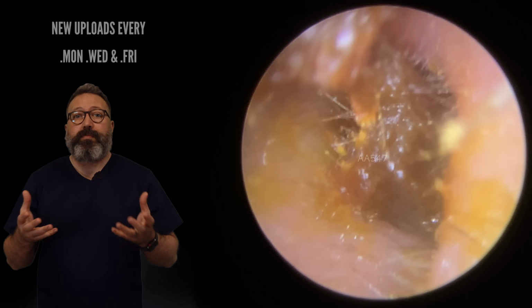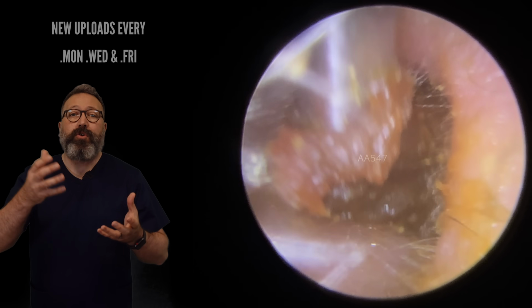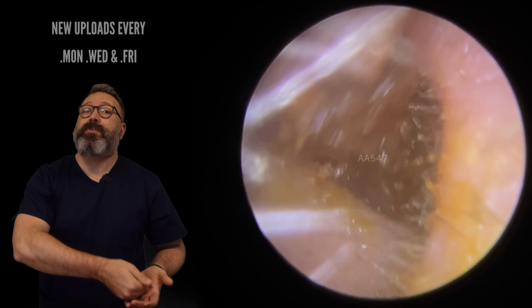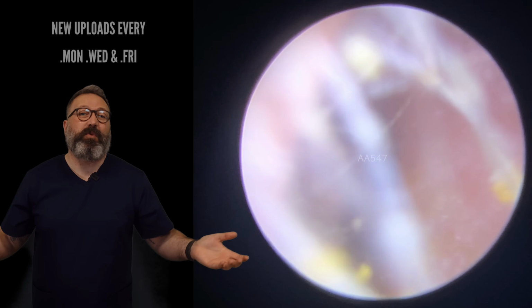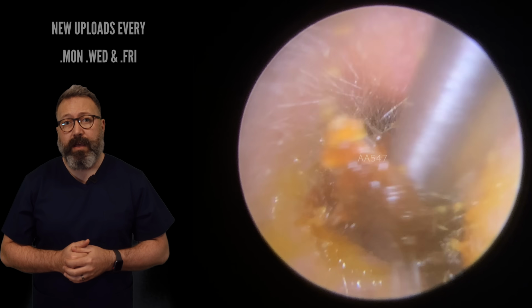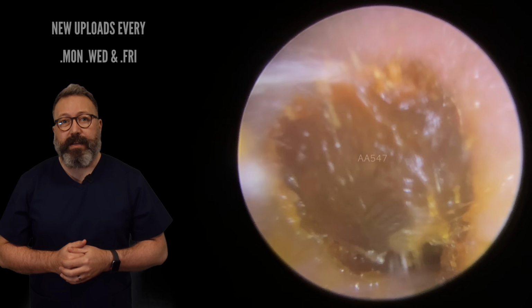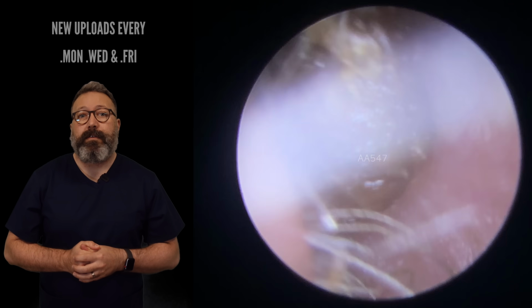So we've got two options. We can either carry on with the suction tube, which I think is what we do in this case, or you could also, when it gets to this point, drop in with the Jobson horn and draw that forward. It doesn't really matter either way, to be honest. We've used both tools, so it wouldn't really matter which one we used. But out, oh, there we go, a little bit of a wiggle, that's coming. Boosh, out he comes. So there we are, that's popped out.